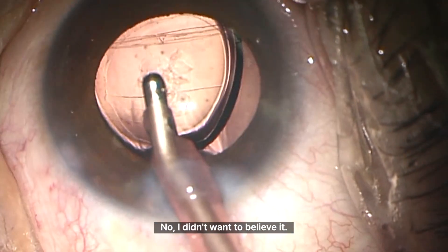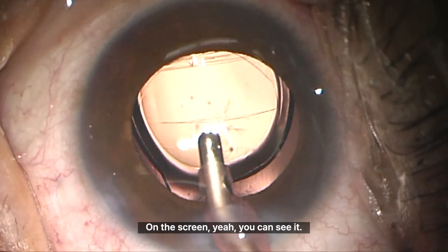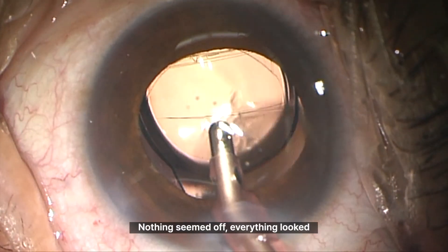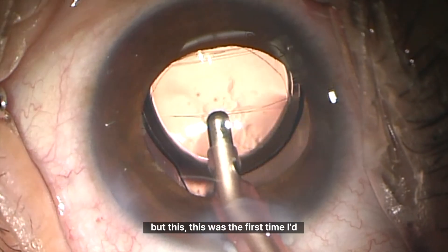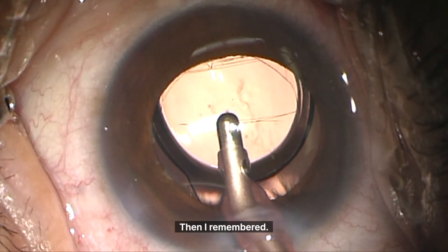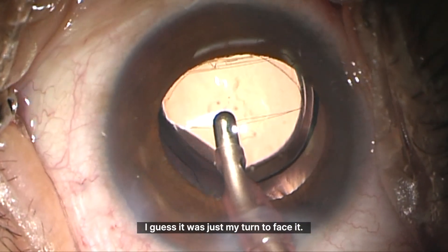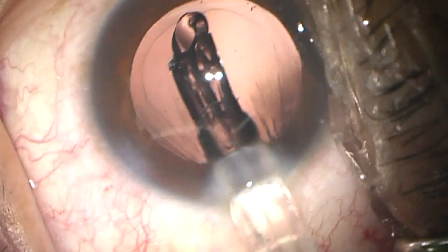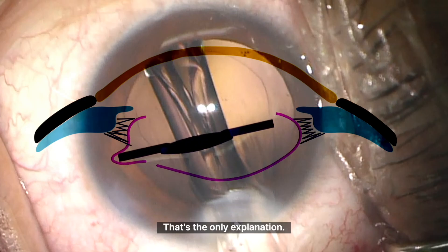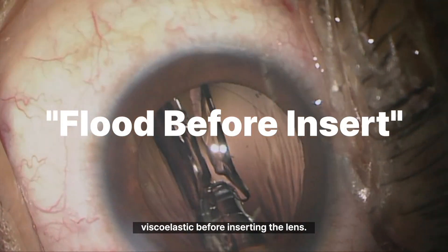I didn't want to believe it, but it was true — a posterior capsule rupture. On the screen, you can see it. I was just blank for a moment. What did I do wrong? Nothing seemed off. Everything looked fine, but this was the first time I'd ever had a rupture happen right in the middle of I&A. Looking back, the cause must have been the tip of the IOL rubbing against the posterior capsule during insertion. That's the only explanation. Since then, I've made it a habit to always flood the bag with plenty of viscoelastic before inserting the lens.